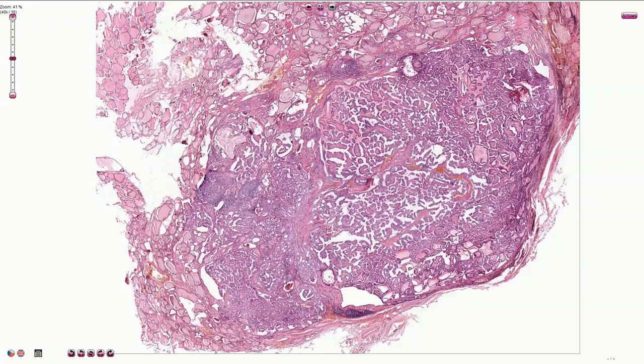Here we are looking at papillary thyroid carcinoma, which is a malignant epithelial tumor showing evidence of follicular cell differentiation, characterized by typical distinctive nuclear features.